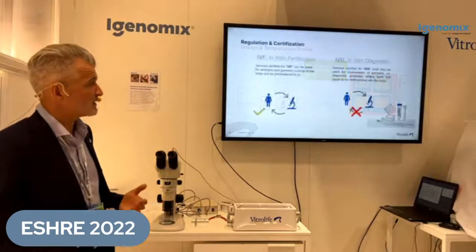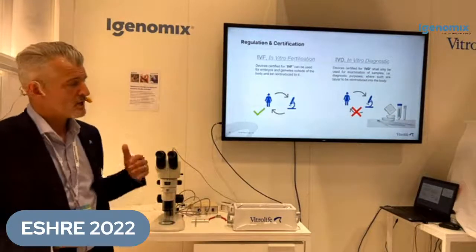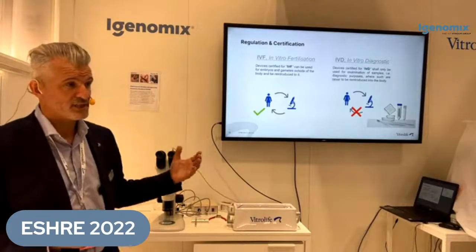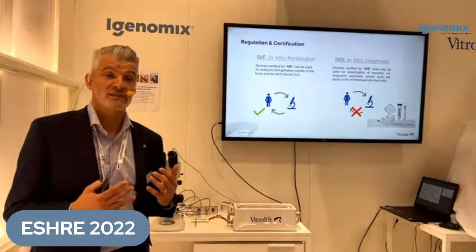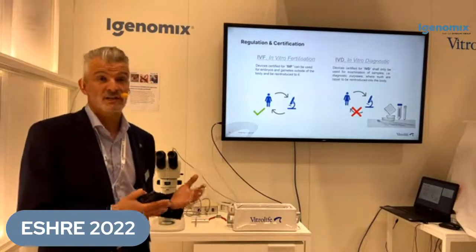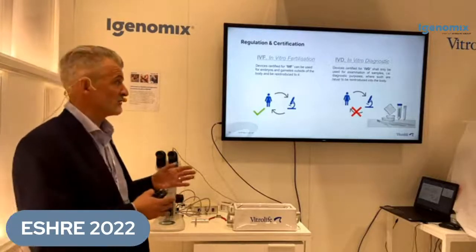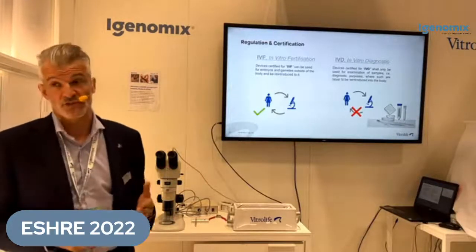And then the final aspect I spoke about earlier was that of certification of the labware. Now this is critical because there are two types of certification out there. You will have plasticware that is certified for IVF use, and you will have plastics that are IVD certified. Now, these are very, very different classifications. Any plastic that's certified for IVF is intended for the culture of gametes and embryos outside of the body and is safe for the reintroduction of those gametes and embryos. An IVD certified plastic, on the other hand, will be certified for the culture of gametes and embryos outside the body, but only for examination purposes. They should not be reintroduced into the body.